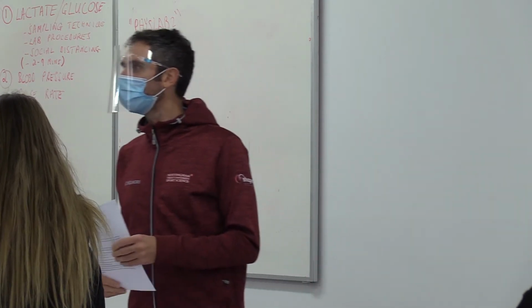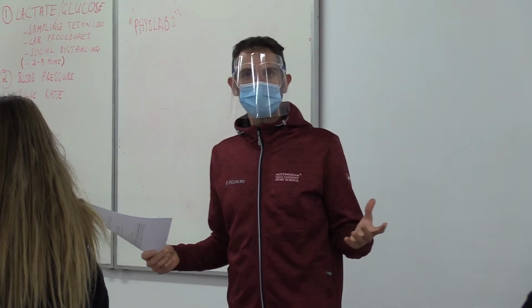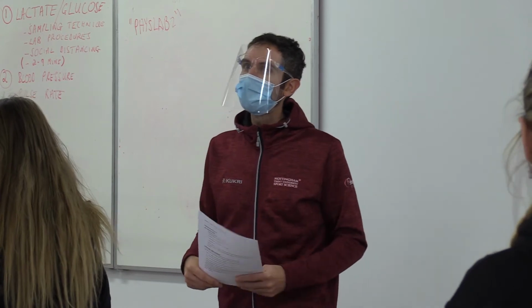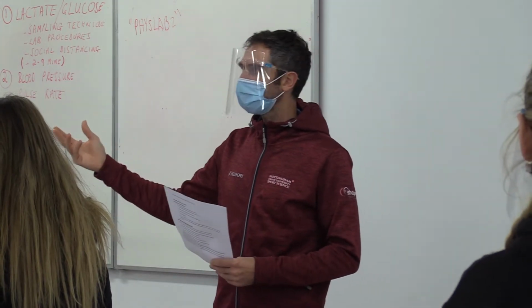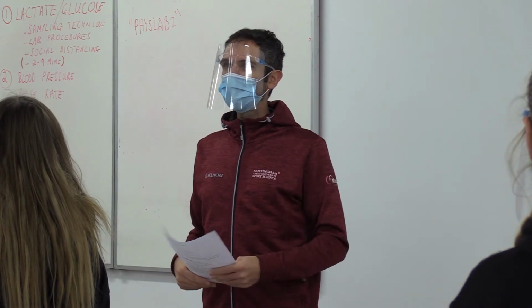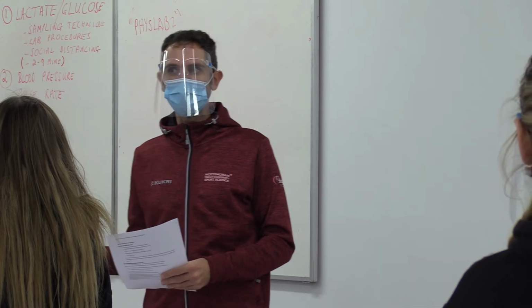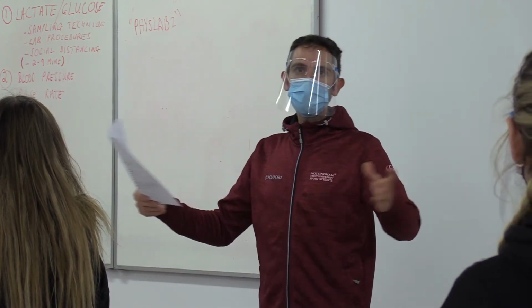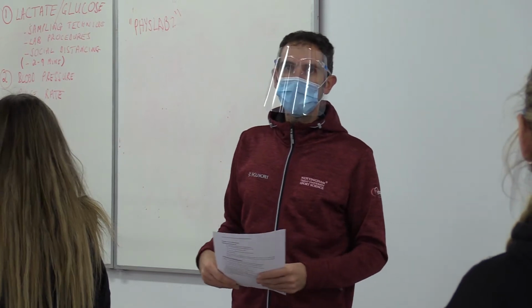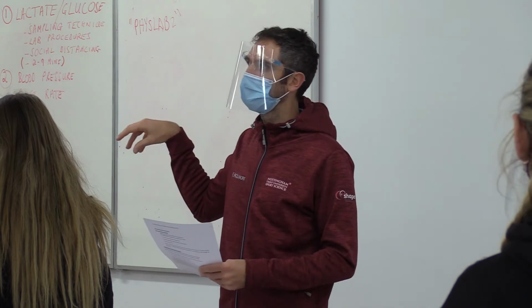Okay, so it could be from an exercise perspective. We might want to know the fitness level of an individual. Okay, we might want to know how fit a sports person is when they're playing their event. So if we take something like running and we look at VO2, we can also look at the efficiency of that person. So let's say we've got everyone in here today to run on a treadmill at this set speed, and we calculated their oxygen utilisation using the technique we're going to do today.